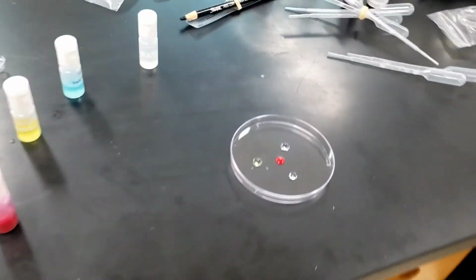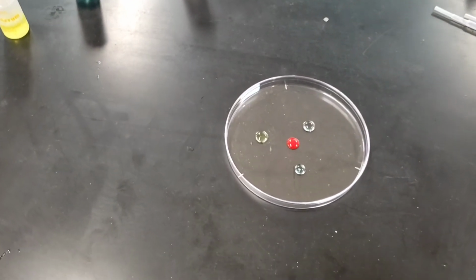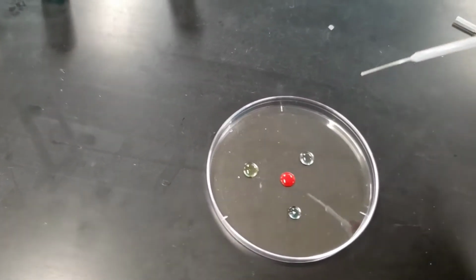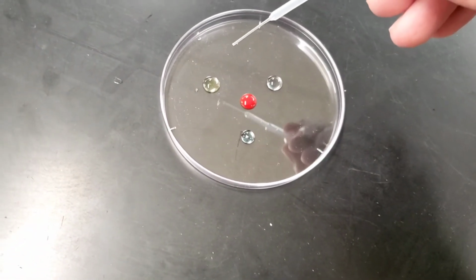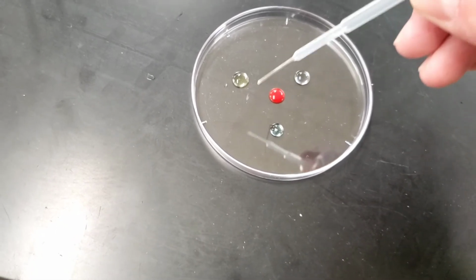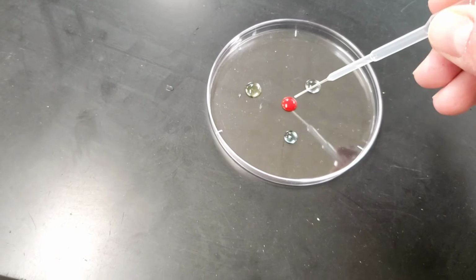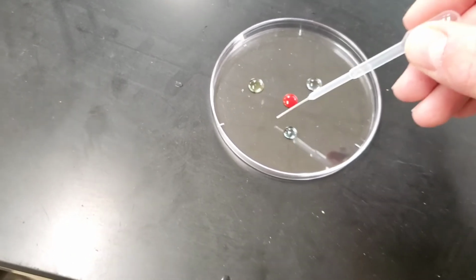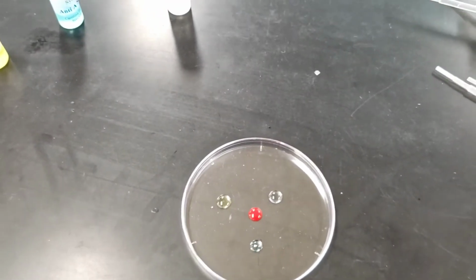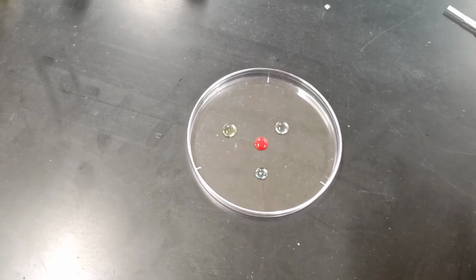So if I blow that up a little bit, here is what's going to happen in the gel. That blood type is going to start radiating out in all directions, and then the anti-B, the anti-A, and the RH, they're all going to start radiating out too. Wherever they come in contact, if you get an interaction, you'll see a white band that forms. And wherever that white band forms tells you the kind of blood type it is, right?